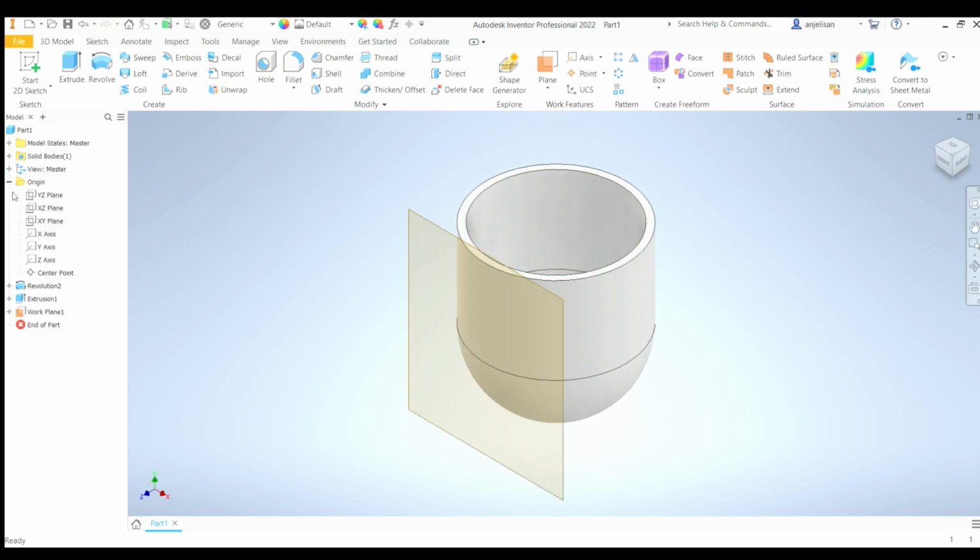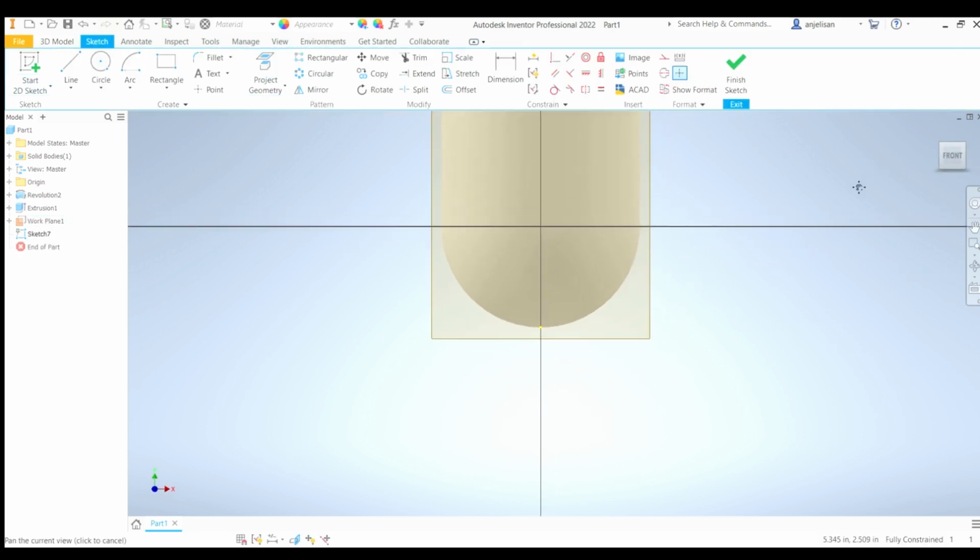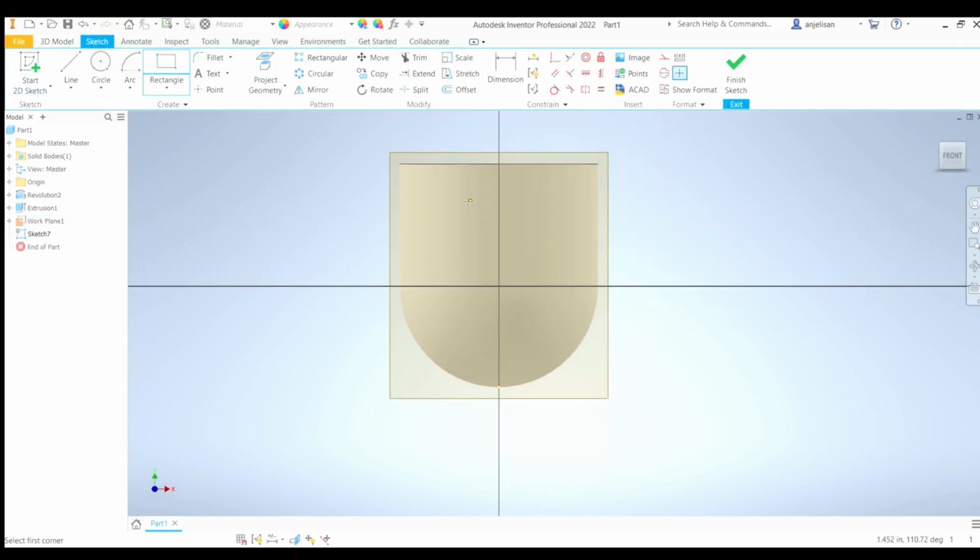That's great. Now let's start a 2D sketch on this. I'm just gonna make a simple little rectangle, and again, we're not gonna go into as much detail as with the other tutorial, just for the sake of covering the basics. But if you really want to know more about constraints, because constraints are very important, you can go to the other tutorial. In this case, we're not too concerned about dimensioning every single thing, or constraining it to this position by locking it into XYZ.